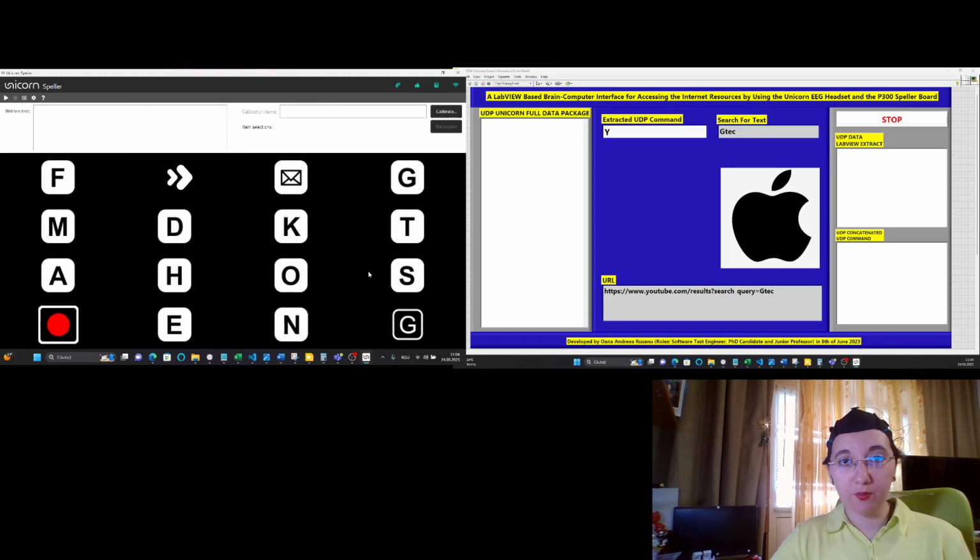The vector interface application that I want to present you is related to searching some texts, some options in Facebook, YouTube, and Google. So the options are related to searching for famous artists such as Michael Jackson, Adele, Ronan Keating, and Tina Turner.